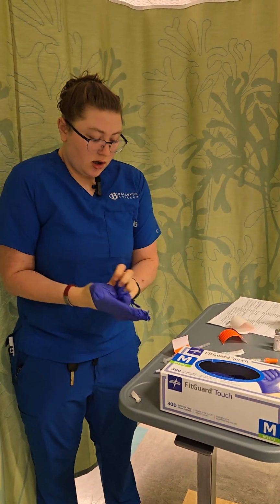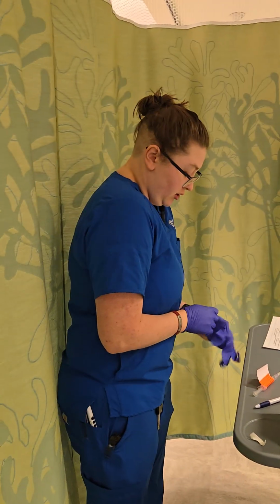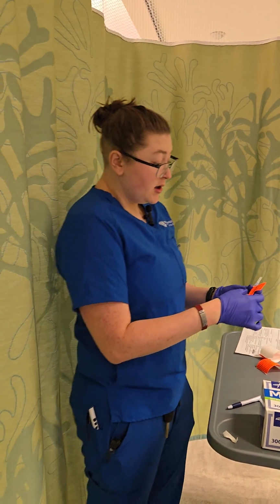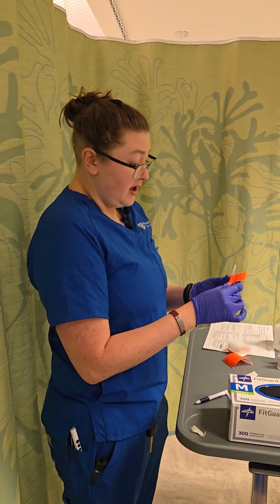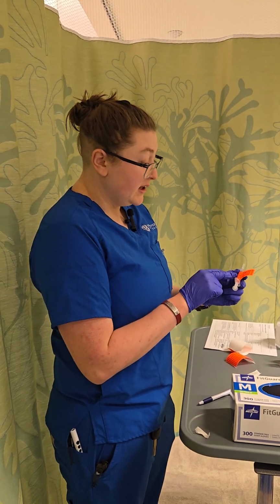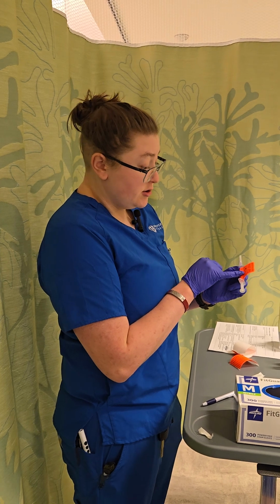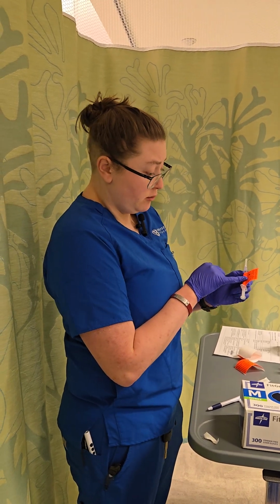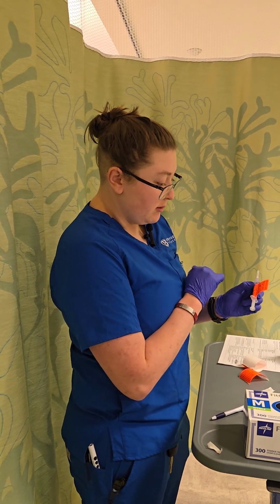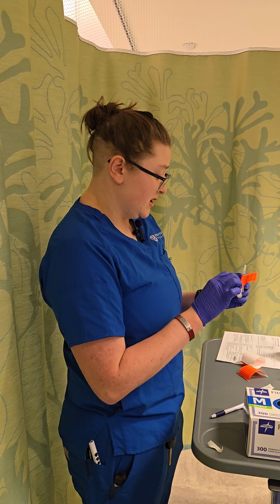So the Toradol has already been drawn up, and it has a label on it. The label details what medication it is, and it's Toradol. The label details the number of milligrams in this medication, as well as the number of milliliters that were drawn up, and the concentration it was drawn up at is 15 milligrams per milliliter. So the milliliters is 1.3 and the milligrams is 20, and confirming on the MAR that my patient is supposed to get 20 milligrams. So that is correct.